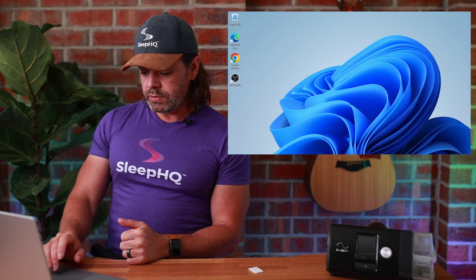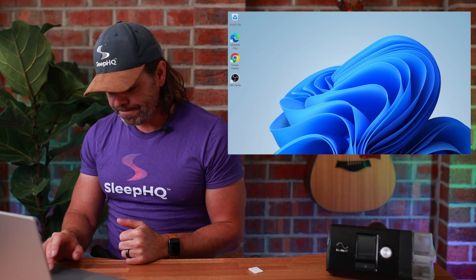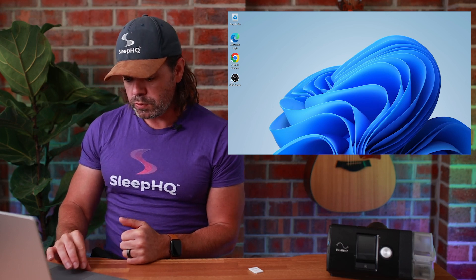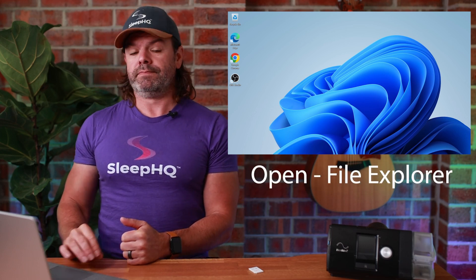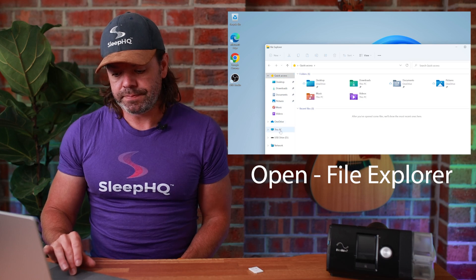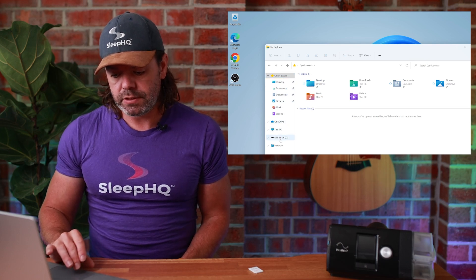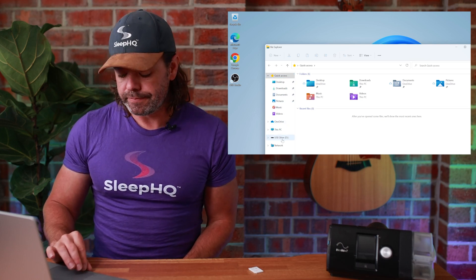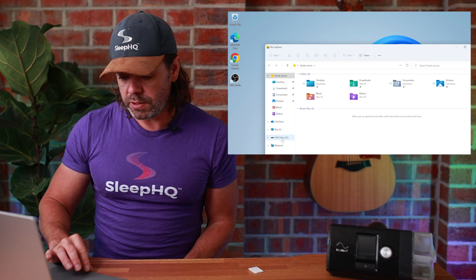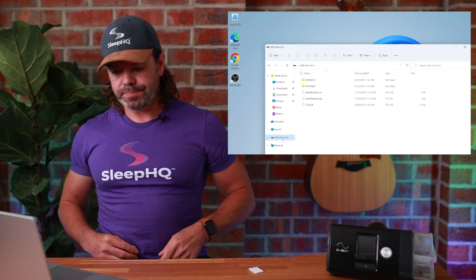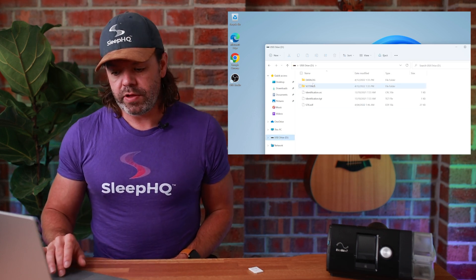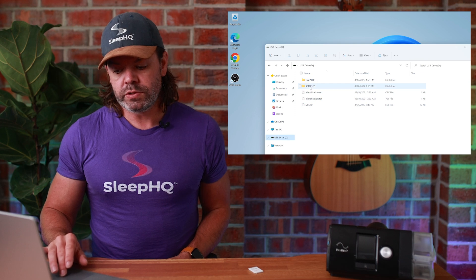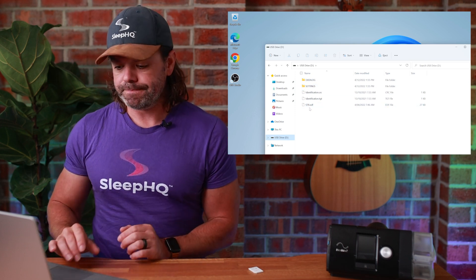Step two, we need to locate the files on the SD card and drag them into the imports folder in Sleep HQ. So on your Windows PC or laptop, you need to go to File Explorer, and then down the left here, you'll see USB drive. Click the USB drive, and here we have the two folders and the three files on the SD card.